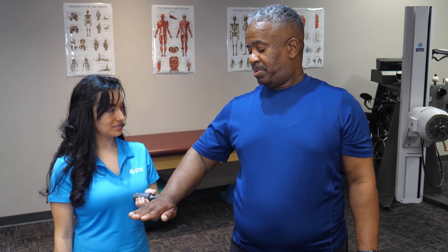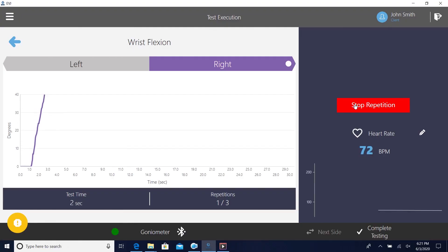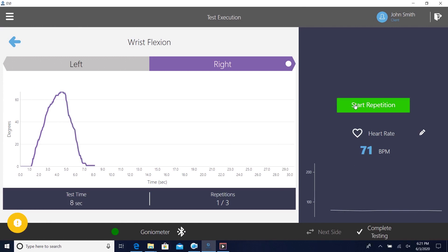Unlike the old plastic goniometers, the EVJ automatically records the data, generates simple reports, and lets you choose the data you want for a quick export. The EVJ is perfect for rehab clinics, functional capacity evaluations, research studies, and education.